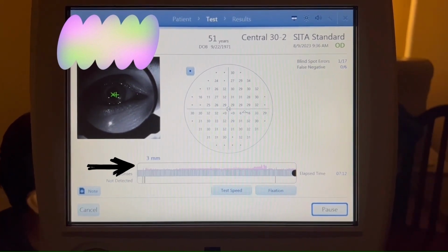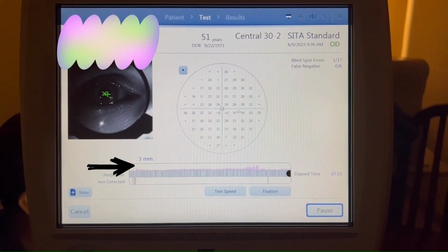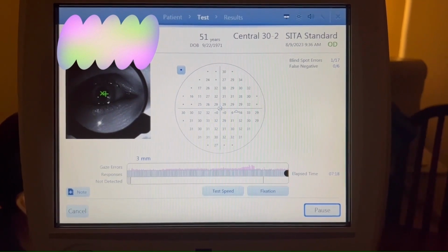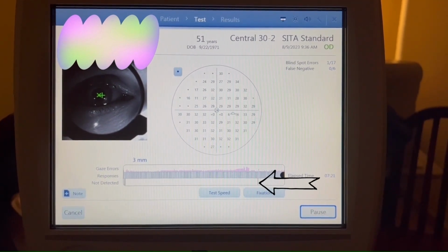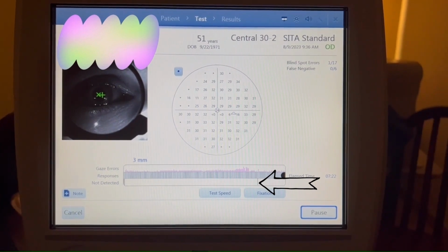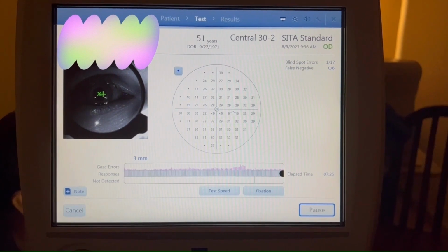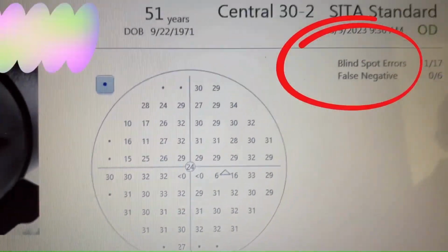Upward markings indicate that the test eye deviated from the fixation target at the time of stimulus presentation. The higher the marking, the greater the deviation. Downward marks indicate that the system was unable to determine the gaze, either due to blinks or other reasons. Test points are shown in numerical values.